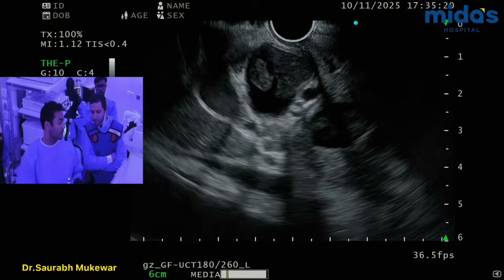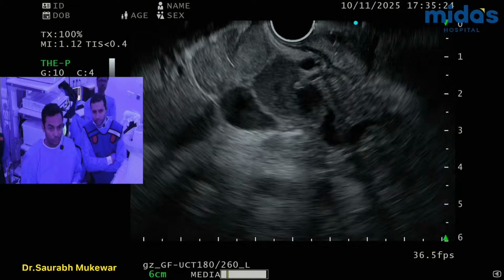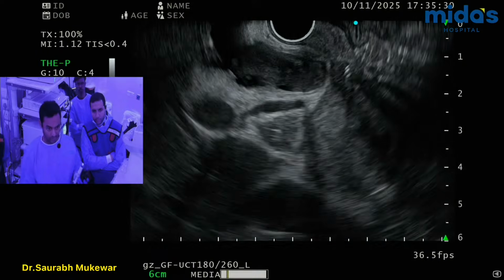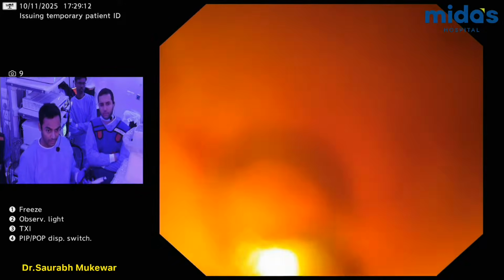What material do you use? Which wire? We use O25 wire, you know, when we do this. So again, now with us, this thing being here, it gets a little stiff now. Let's see if I can.